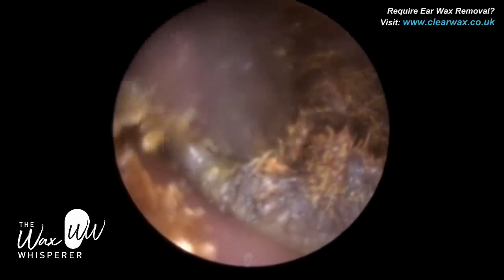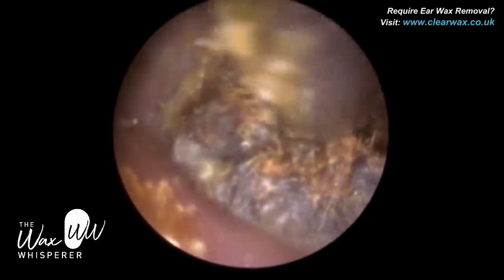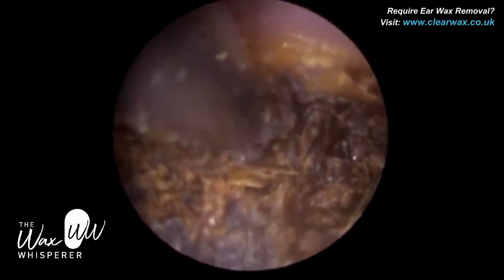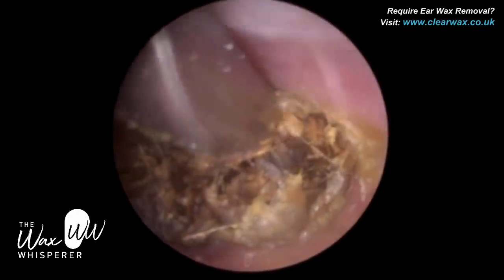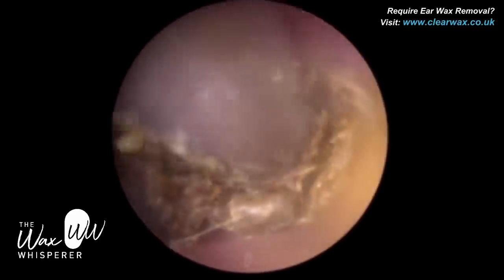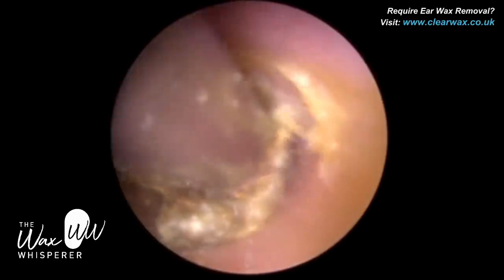Going back in with the microsuction tip, just suctioning some of the remnants from that last visit with the earhook. About half a centimetre to a centimetre away from the eardrum we have a narrowing of the ear canal called the isthmus, and then the ear canal protrudes outwards again. This plug of wax is lodged beyond the isthmus — there is a segment of wax that is larger than the isthmus, sitting more medially towards the eardrum. The key is how do we get that out, bringing it forwards through the narrowing. It's a bit of a game of physics as well.